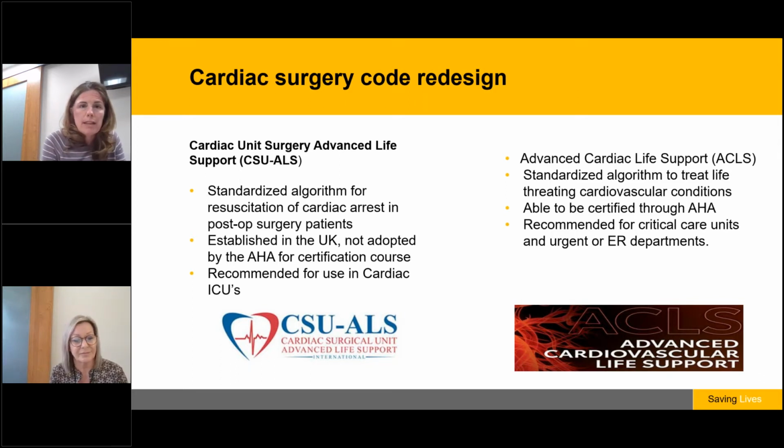And what's the best practice with that? The biggest differences between ACLS and CALS, because I could do a whole talk on this, I'm going to get down to the nitty gritty, is for ACLS, you do one shock. For CALS, you're going to do 3 stacked shocks. The 3 stacked shocks allow us to bring 78% of the patients back with the first shock, 35 to 45% with the second shock, and 14% with the third shock. So our patients really need electricity first.